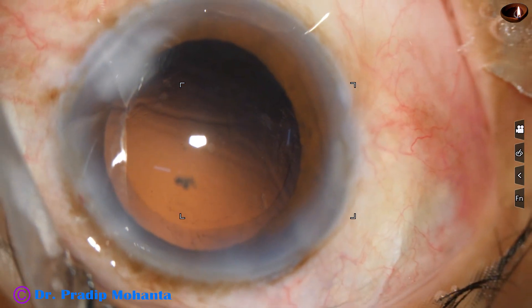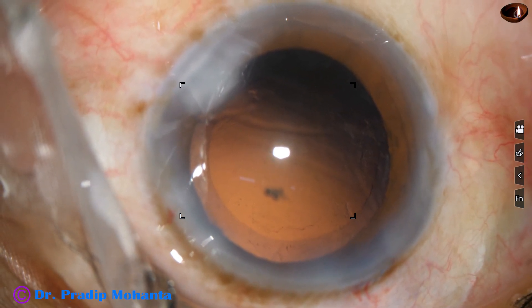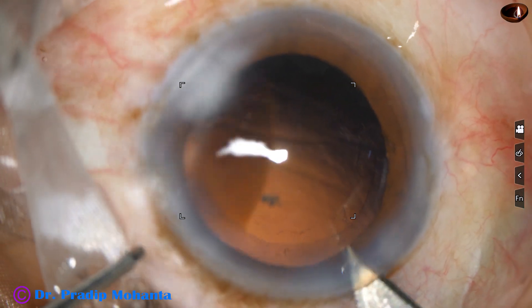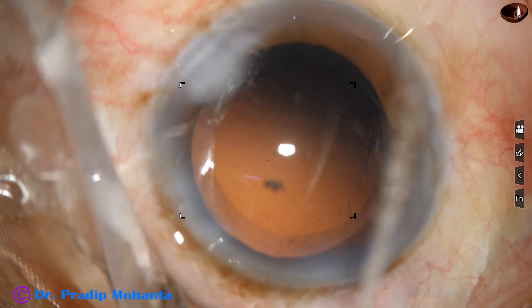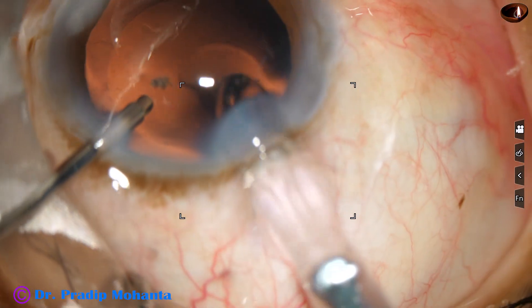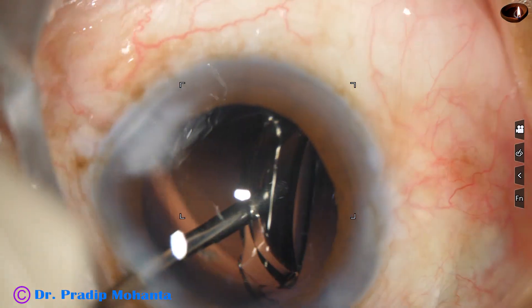The nucleus has been nicely managed. In this case, a Sensar 1 lens from Johnson & Johnson is being implanted. I am enlarging the main wound a little bit. Size of the wound becomes about 2.9 or 3 millimeters. Here goes the intraocular lens. The leading haptic goes into the capsular bag, and the trailing haptic is also placed in the bag.